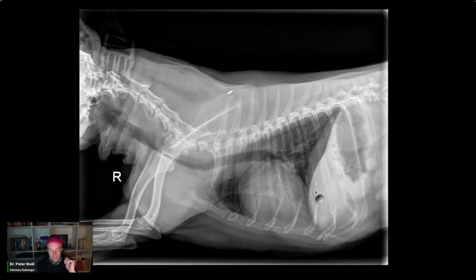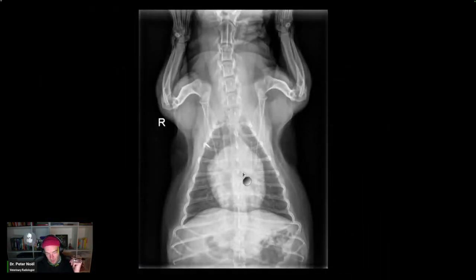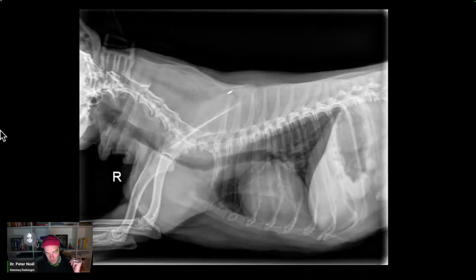So I think this is a case where you've got this dorsal tracheal opacification, and then maybe you can talk about some left auricular bulge, and you're talking about mitral valve disease sort of at most. But the reason I wanted to bring this up is because at one point there was a confusion or just questions related to the tracheal collapse and when you can call it tracheal collapse, because conventionally we're taught that you can't say that the dog has tracheal collapse. Or to me, if you use the word tracheal collapse, I think you're implying that there's maybe a chondromalacia.